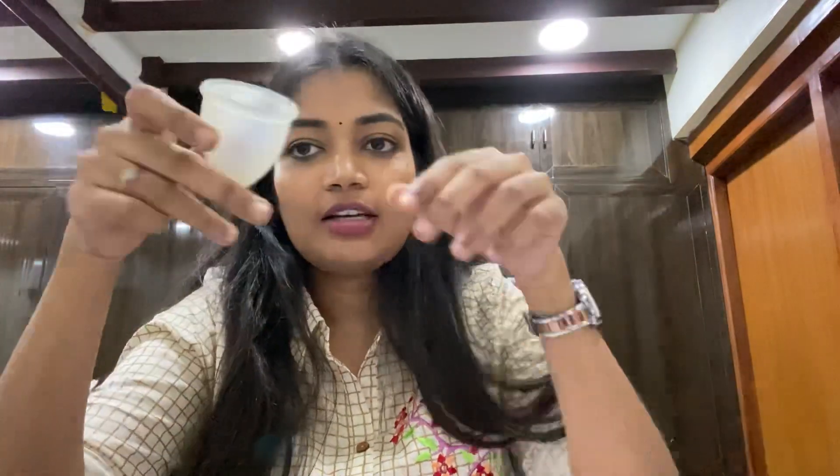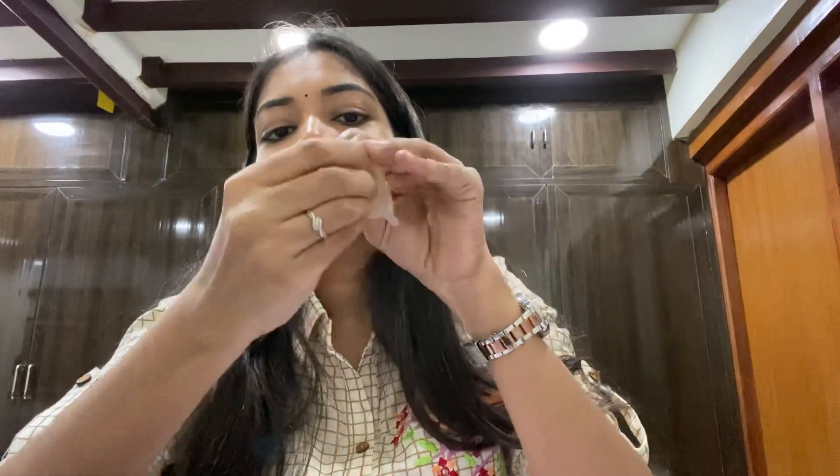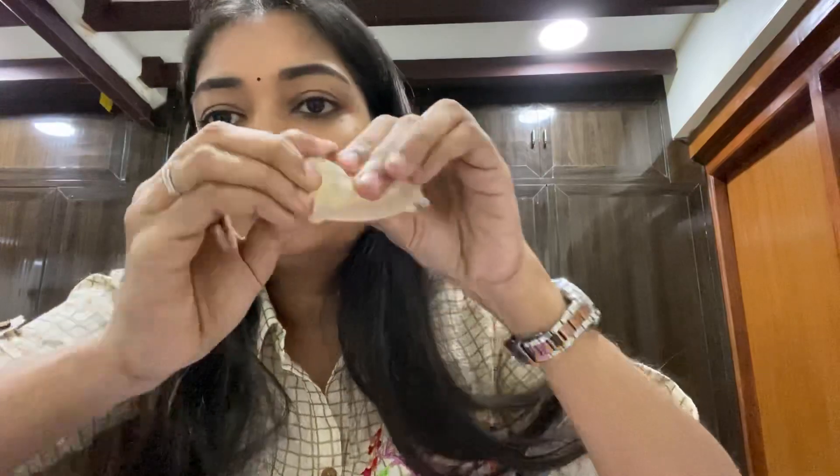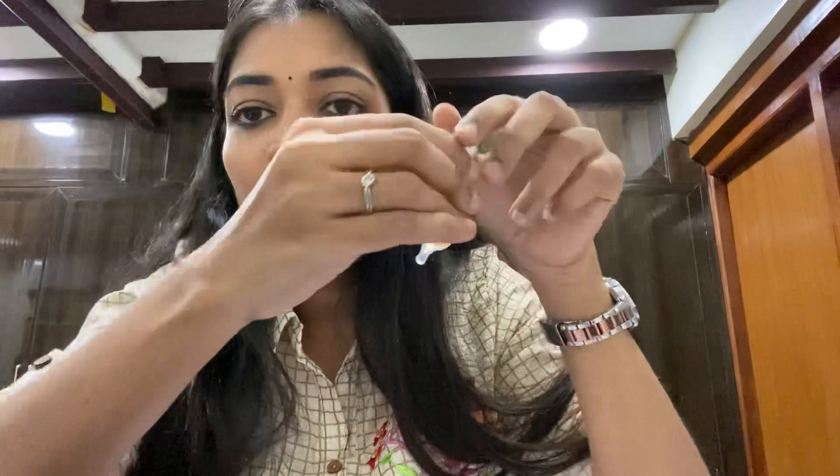Choose a comfortable position to insert: squat, use a western toilet, or an Indian toilet. The most common folding technique is the C-fold — you fold the cup into a C shape to make it smaller for easier insertion.